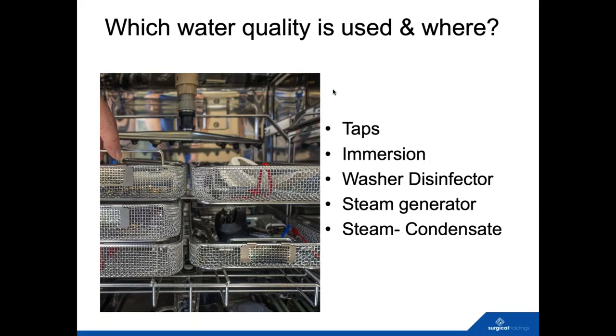No, that's really interesting. We've seen recently on the decontamination side of things inconsistencies with where surgeries are using saline, such as cardiovascular surgeries that require the use of saline and can't use sterile water. That adds to the mix as well, and can be a real challenge to then pinpoint where the potential issues are occurring. So it certainly keeps you on your toes.